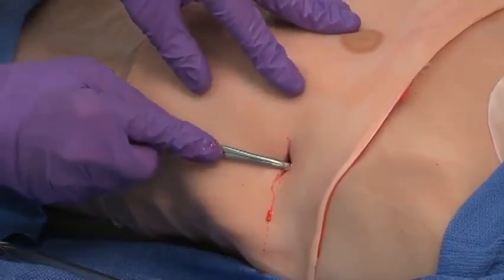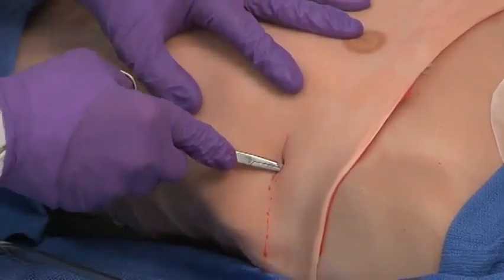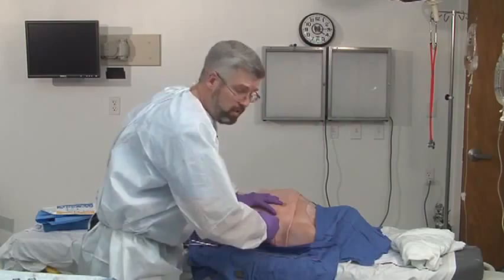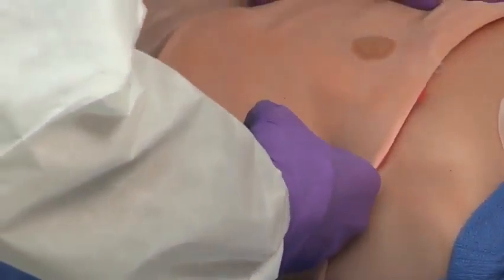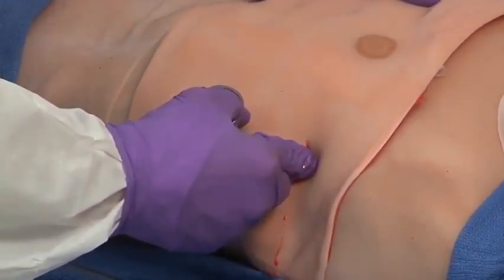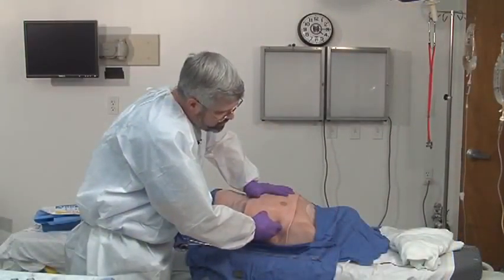You're going to go directly over the rib that you put your finger on a moment ago, and you're going to push up and over the rib and into the chest. This maneuver requires a substantial amount of force if done properly, and you generally will feel a large pop. In a young, healthy, muscular patient, this can require quite a bit of effort, so don't feel nervous about pushing too hard.